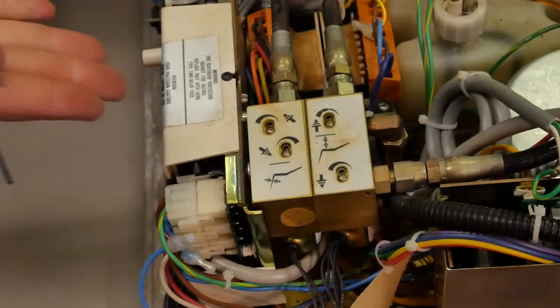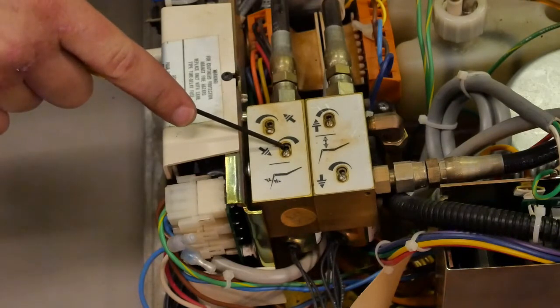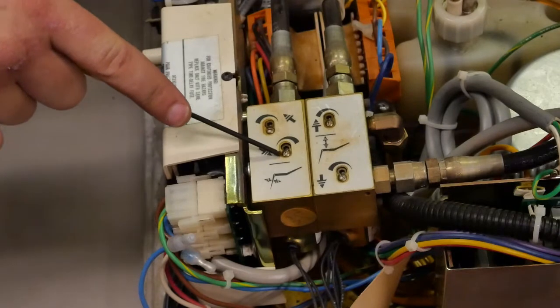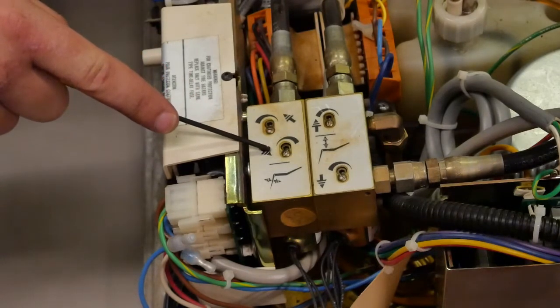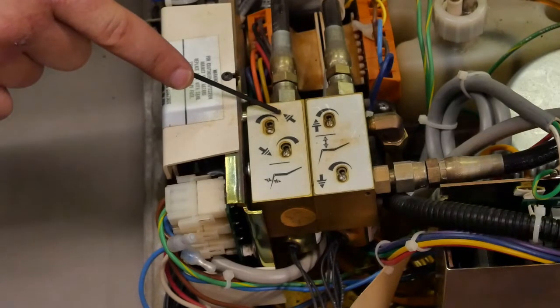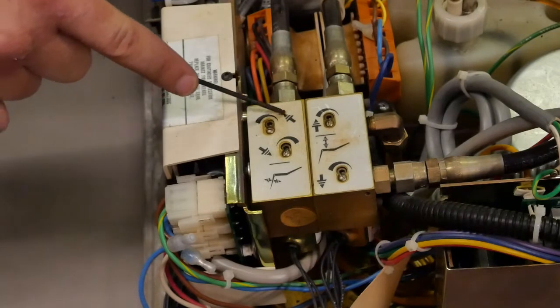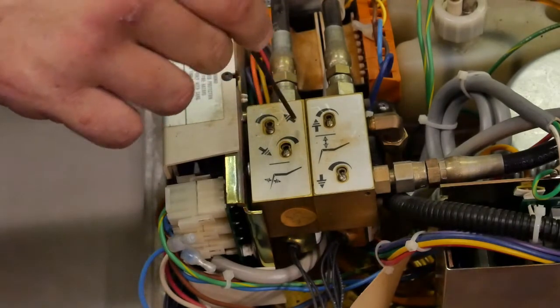So here's your two manifold systems. We have your chair back, this one's your up, and this one's your down. If you notice, for the chair back up, you go clockwise to go faster and counterclockwise to go slower. And for the chair back down, you go the opposite. You go counterclockwise to go faster and clockwise to go slower. So you just turn it to go faster, turn it to go slower.